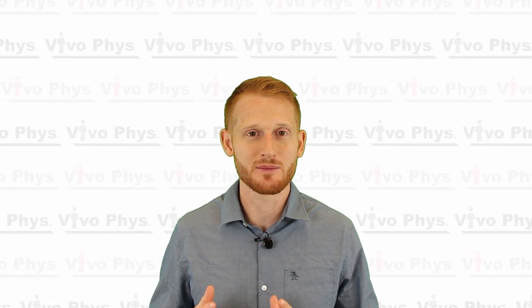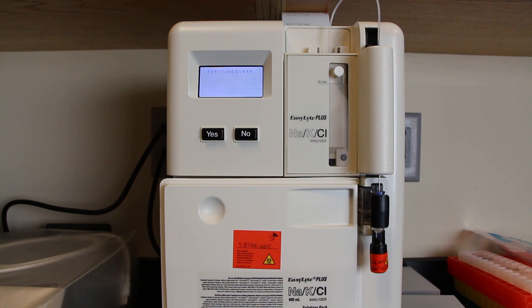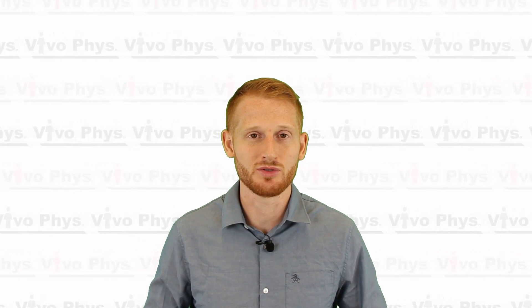Hi, I'm Dr. Edward Matthews. I'm here at Montclair State University in the exercise science lab to show you how to use the EasyLyte Plus electrolyte analyzer from Medica. We're going to be turning it on, showing you how to do the quality control, the calibration, and then how to run a blood serum or plasma sample.